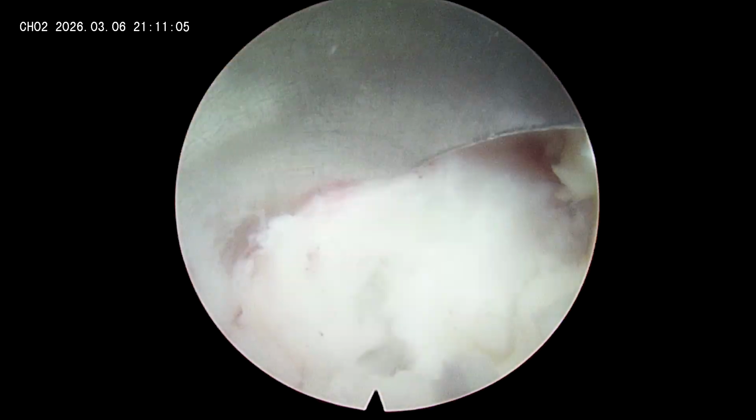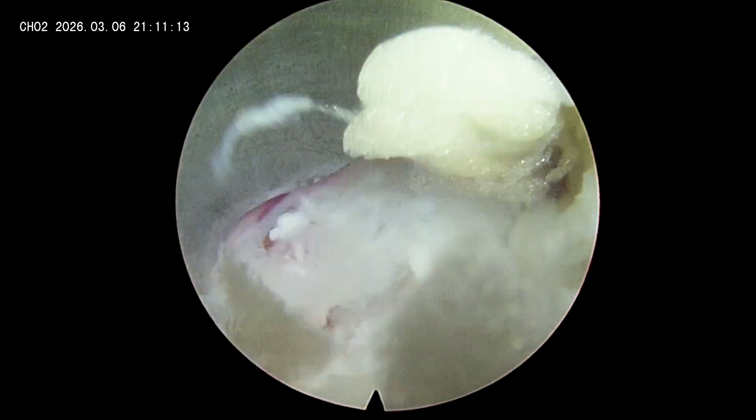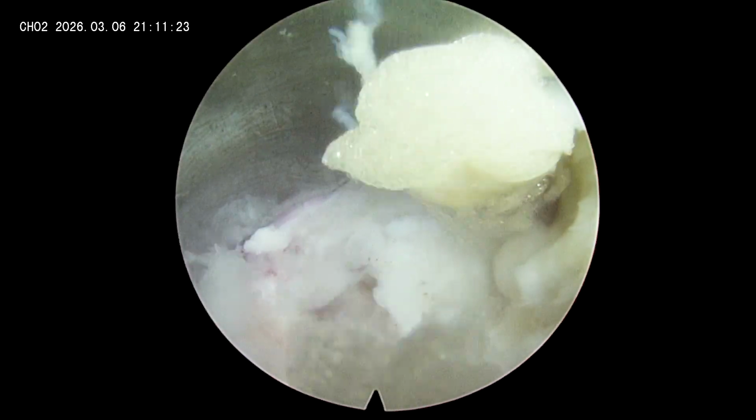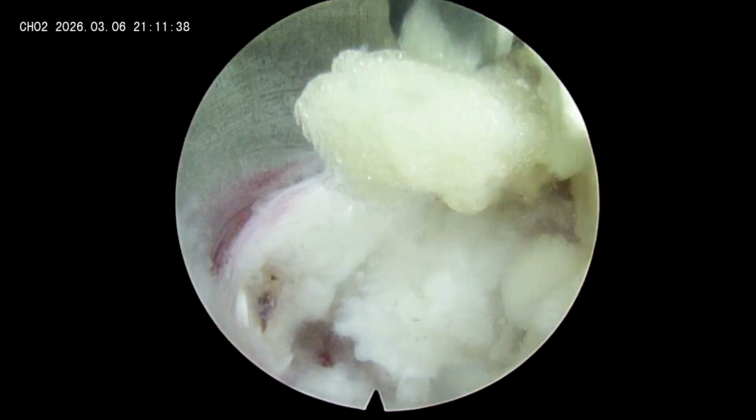Here the next important step is to remove the free fragment from the disc space. So I'm exploring the disc space for free fragments. As already told, in a young patient the disc material is very sticky, so it will take a lot of effort to remove the free fragment from the disc space here. Better, you can shrink it with the help of a radiofrequency ablator as well.